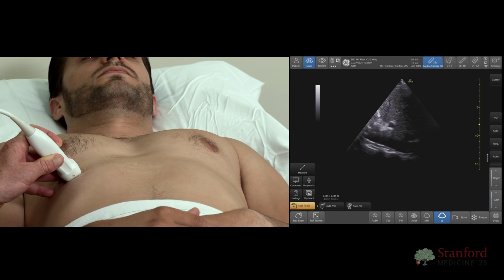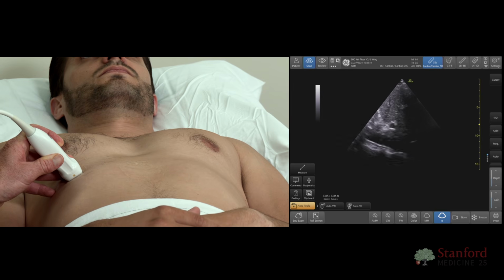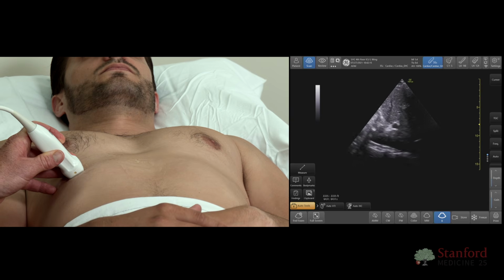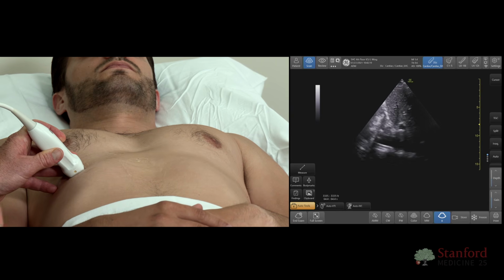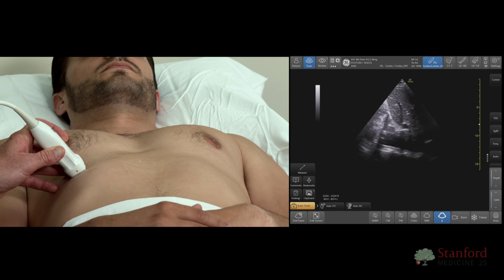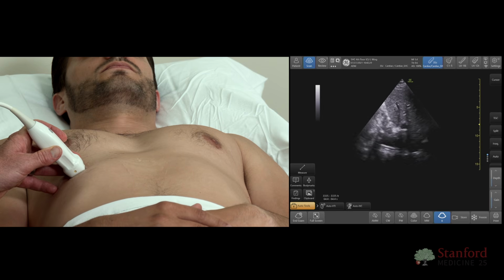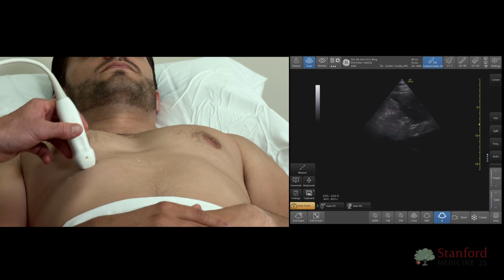Now notice this angle that I'm at. This makes me a little bit nervous, okay? Again, if you imagine the IVC as a circle, and I want to look at collapsibility, well, when my patient does their sniff, if the IVC were to move anterior or posterior, it'll look as if it's collapsing when it's not. So you do want to be a little bit careful when you do a sniff test and you're at an extreme angle like this. You may interpret that incorrectly. So you really want to take that into account when you're trying to interpret your images.